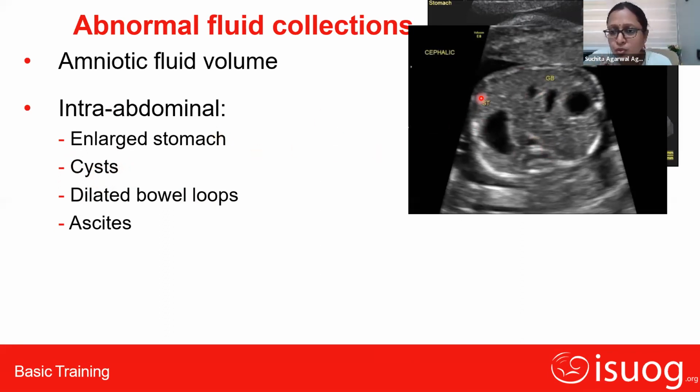So just to recapitulate the situs in this patient, you see there are basically two anechoic structures in the abdomen. One is the stomach and one is the urinary bladder. Two bigger structures, and other smaller structures are the umbilical vein and the gallbladder, which we consider as smaller structures. Any other anechoic structure apart from the stomach and urinary bladder needs referral. It needs further investigation.